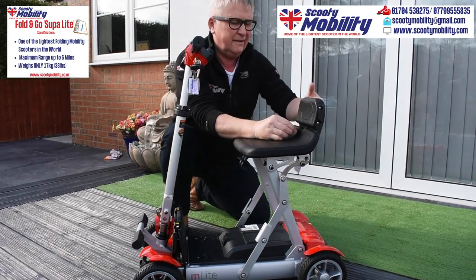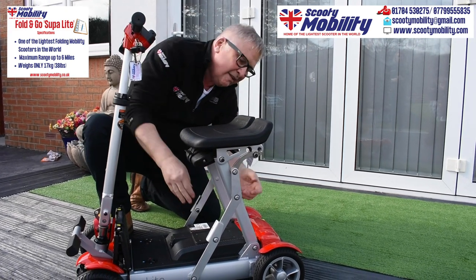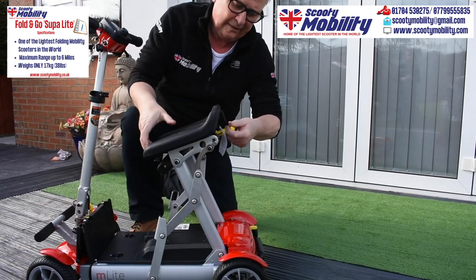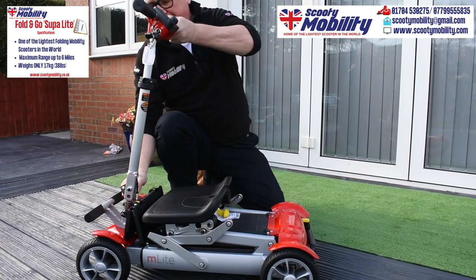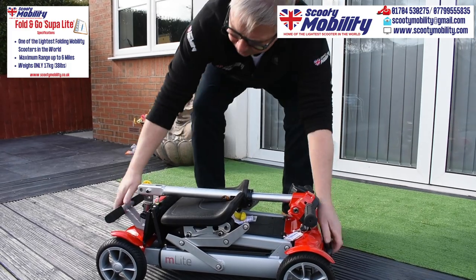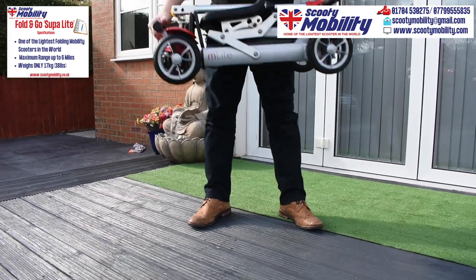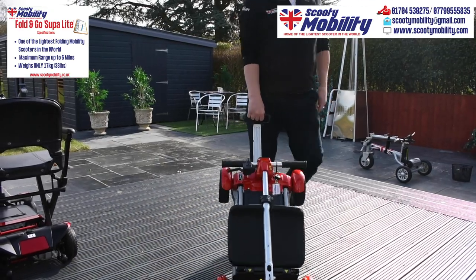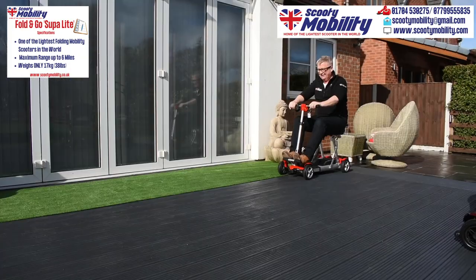The seat tucks away underneath. Pull a little handle at the back there to fold the seat down, and then the tiller steering column folds down and is secured. Very, very easy to lift — there's a handle at the front and at the back. This only weighs 17 kilos, so it's world beating. You can tow it around like a suitcase behind you with the extended handle that folds away. Very agile, very nimble, and great looking. Really pleased with this scooter.